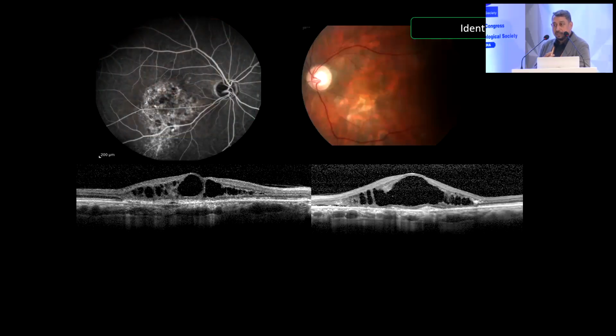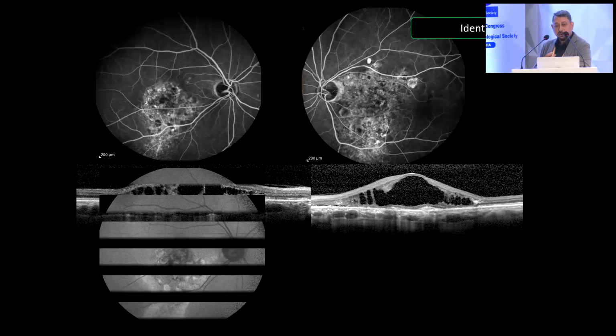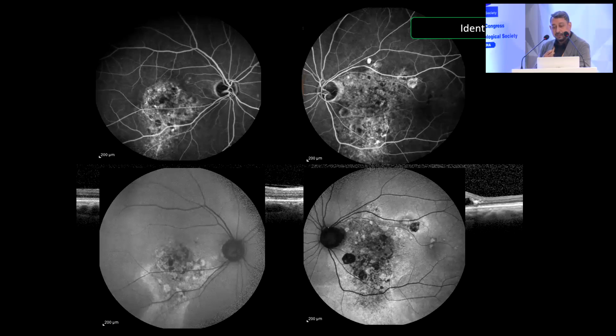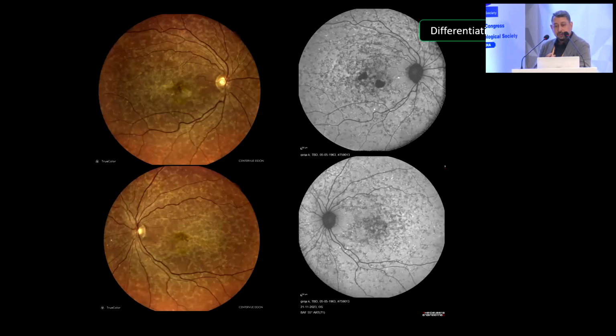In this patient, you see cystoid macular edema, while in the autofluorescence, you see extensive areas of involvement without intermittent areas being free. That tells us this is beyond a regular CSR, it's beyond multifocal CSR, and it's reached a stage where the RPE is sick, and it's called the sick RPE syndrome or a diffuse retinal pigment epitheliopathy. This is another case where the progression of the disease from simple CSR to multifocal CSR to sick RPE syndrome is well documented in these patients.